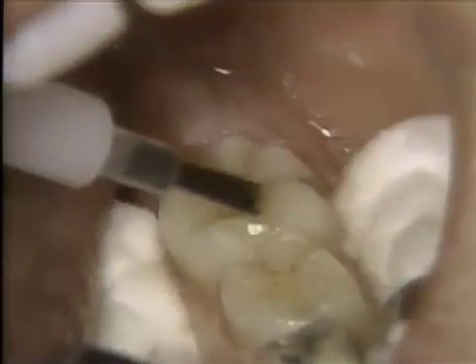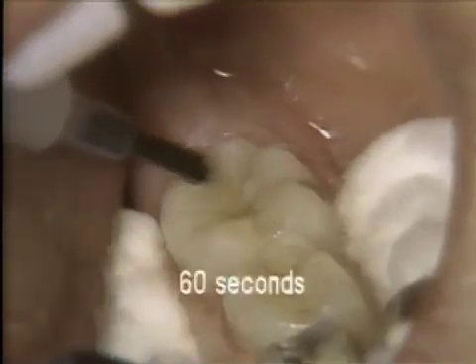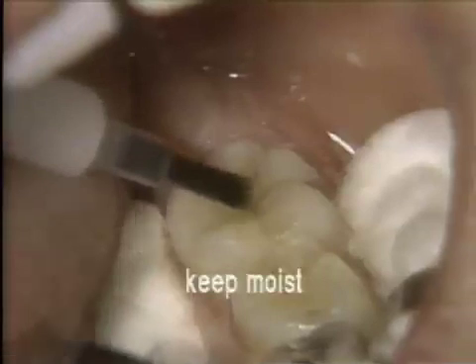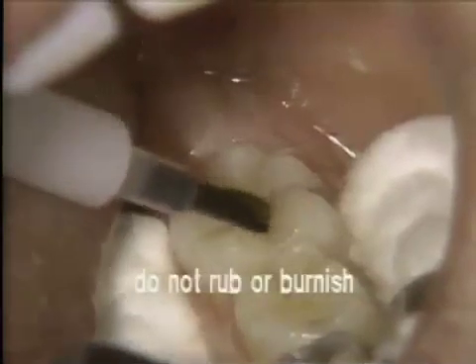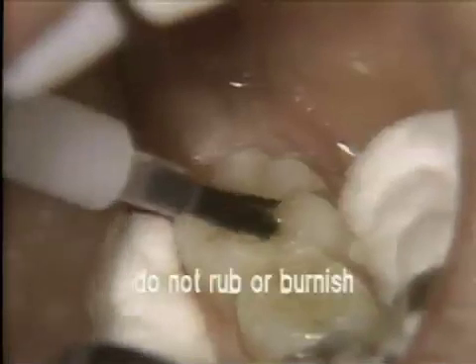The tooth surface is then etched with phosphoric acid for 60 seconds. If a liquid etch, as demonstrated here, is used, the surface should be kept moist with acid and not allowed to dry. The solution should be applied with a gentle dabbing motion to keep the solution agitated. The surface should not be rubbed or burnished with the applicator, since burnishing will smooth the enamel surface and decrease the eventual bond strength. If a gel etch is used, it should be left undisturbed during the etching period.